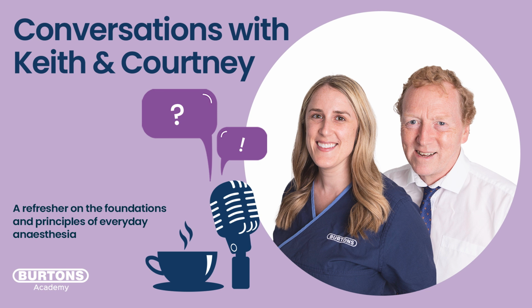So I was really quite surprised and quite disappointed that my life so far I've been sort of misled as to the amount of argon in the atmosphere, and how I could get to this age without realizing it. But it's quite important because concentrators concentrate, they take 21% and turn it to 100%. So they do a 5 times concentration ratio. And they do that to argon, don't they?